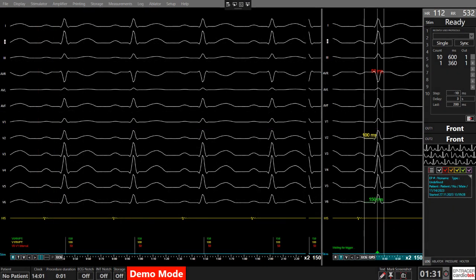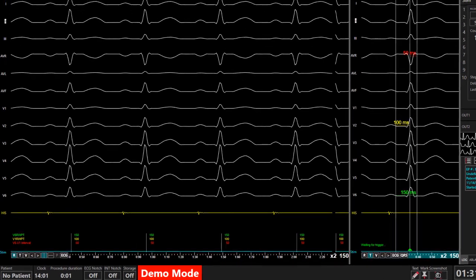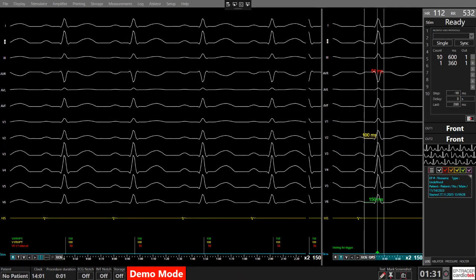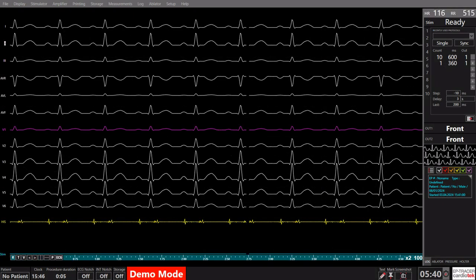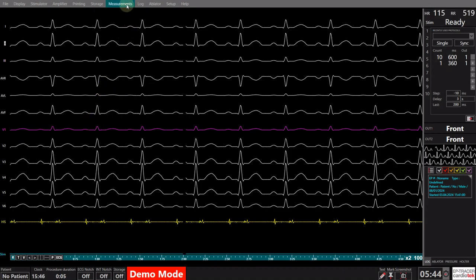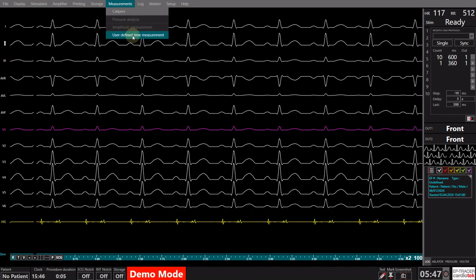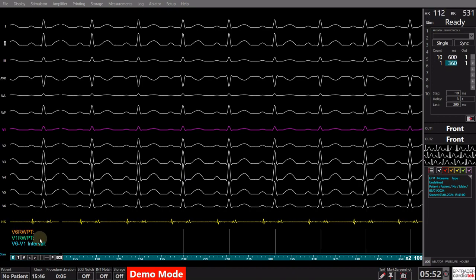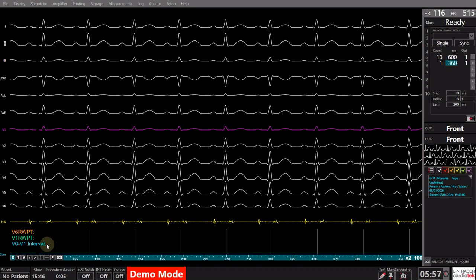Moreover, the EP Tracer system offers a user-defined time measurement function, empowering users to observe multiple time measurements triggered by various events, such as stimulation spike, V1 R wave, or V6 R wave. This feature enhances the system's versatility, providing clinicians with a comprehensive toolset to tailor time measurements to specific procedural requirements. To activate these time measurements, simply access the measurements option in the upper menu and click on User Defined Time Measurement. This will display the different measurements on the lower side of the screen in real-time, so that clinicians can evaluate the difference over a series of beats.